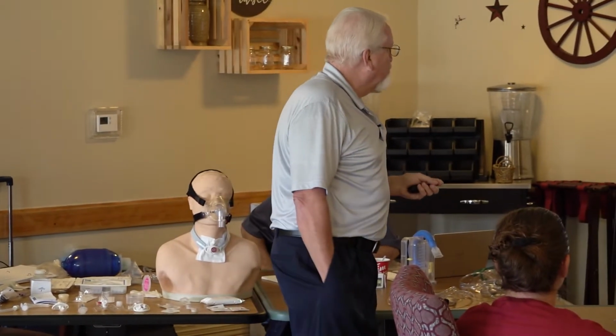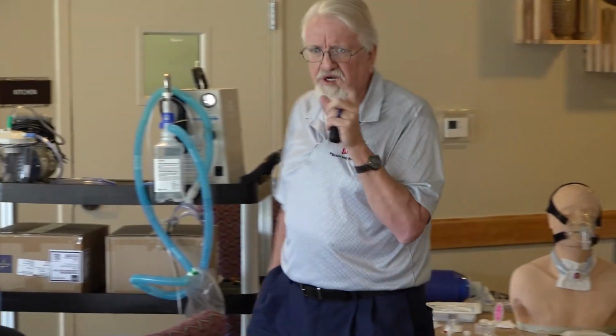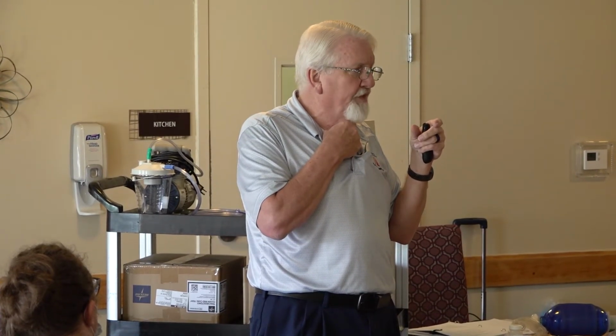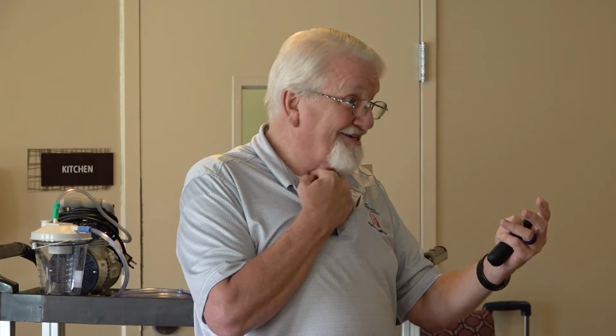I would assume it is similar to the button a tracheostomy patient can get, which, well, it'd be a little bit different, I'm sorry, because the tracheostomy button actually goes from the airway to the outside of the stoma, has a little fitting so it kind of stays locked in, and it's like not permanently capped off, but it's not a cap that you would be removing here, okay? And it provides permanent access to a stoma if that patient were to have to go back.